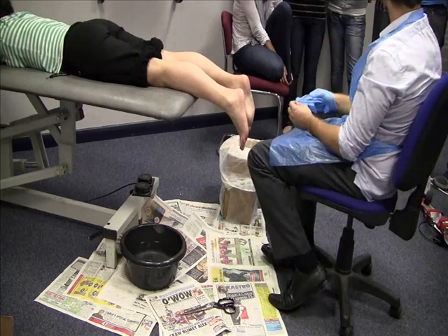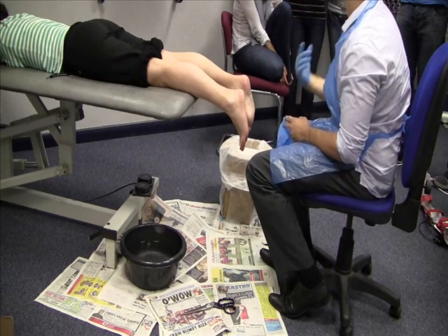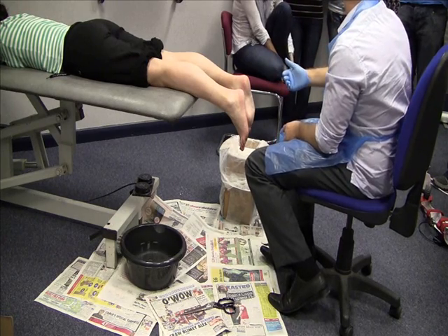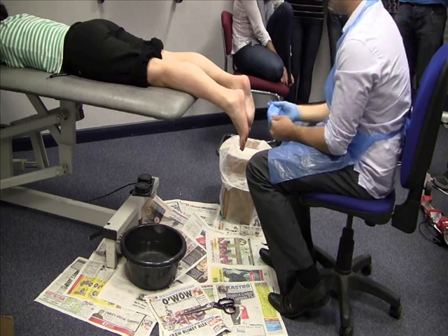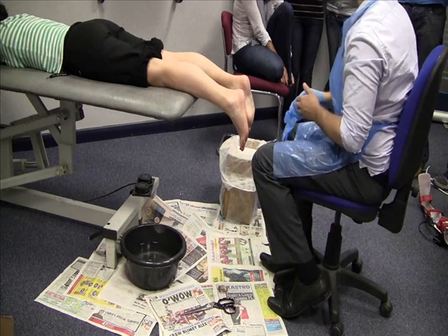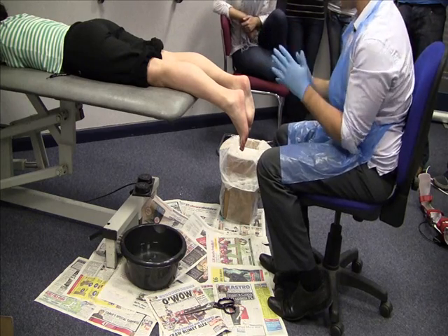Does anyone do suspension casting? Where you hold the fourth and fifth and hold the foot up. Sometimes it's quite good with children or if you have clawing digits — you might want to elongate the foot slightly. The issue with that is if you've got quite a heavy patient, you can get fatigue very quickly, especially if it's a slow-drying plaster like the one I'm about to use.